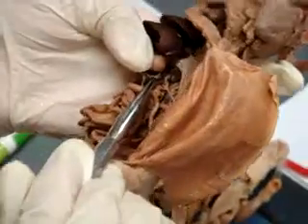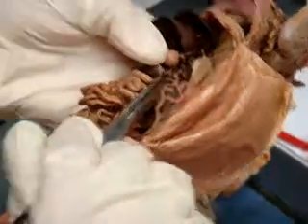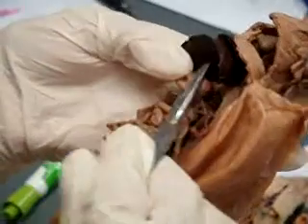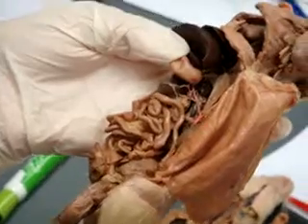See if I move that gastric artery over. See that third one right there? That pink one? That one goes up to your liver. So that's your hepatic. Okay?